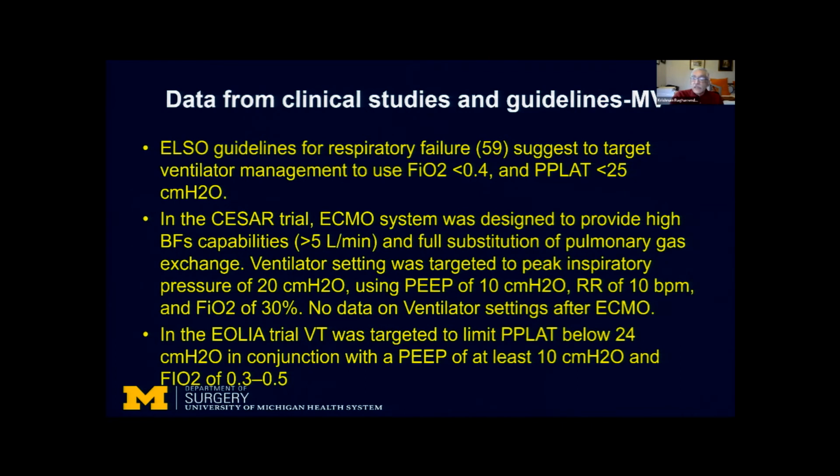There are two large studies that anybody who has done ECMO talks about. The CESAR study, which was done in the UK. And unfortunately, the CESAR study did not have any documentation of what the ventilator settings were following the insertion of VV ECMO cannulas. So pretty much that is not very helpful in figuring out the appropriate guidelines for mechanical ventilation.